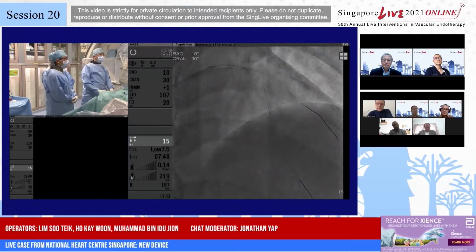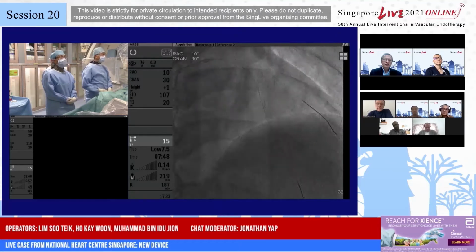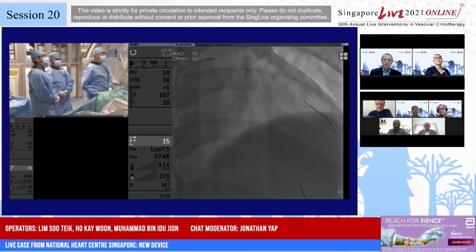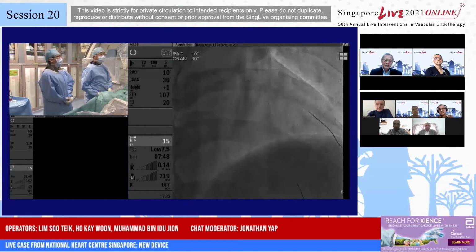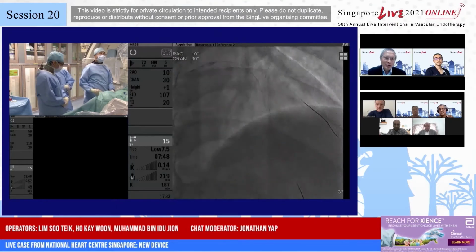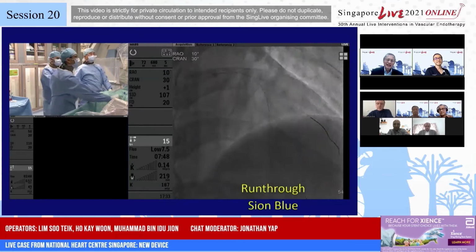Any experience with overlapping two bioadapters so far for those who have this stent available? Maybe you can ask Dr. Colombo. He probably has the most experience with this device.